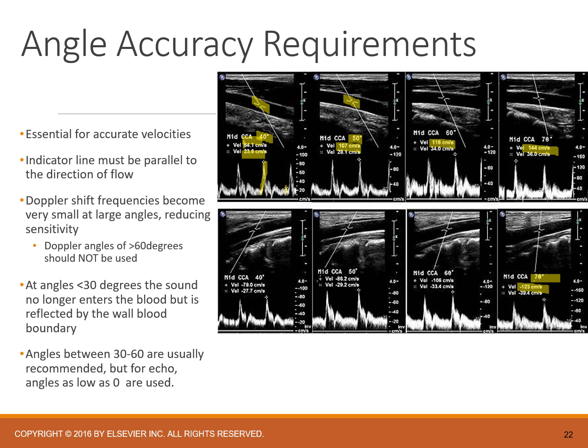So you also see that the waveform starts to change. So they've made the rules, and the rules are intact that it should be 0 or 30 to 60, because our velocities get more and more inaccurate if we go over 60.